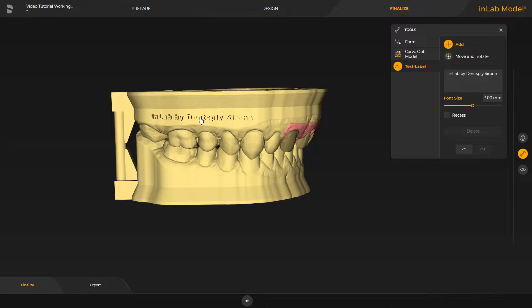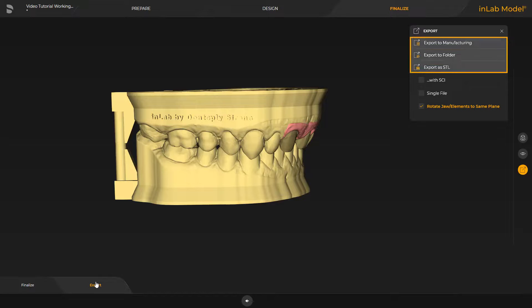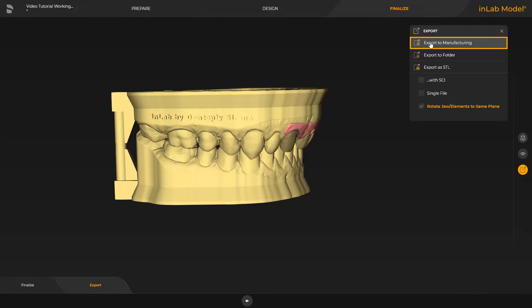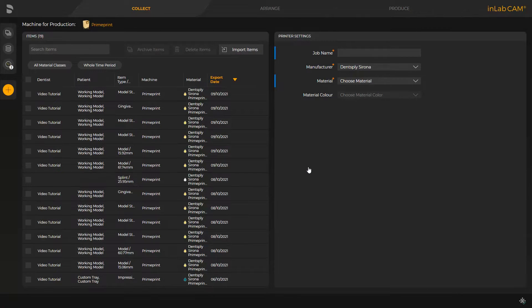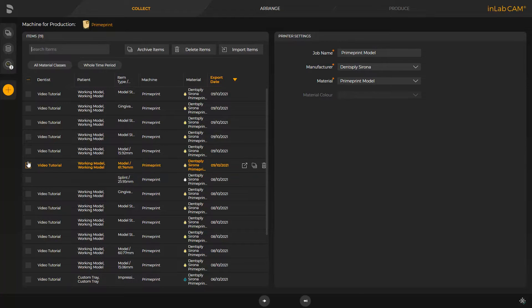In conclusion, we switch to the last step, the Export step. Here, different export options are provided. Since the CAM data folder has already been determined, as mentioned earlier, the case is seamlessly transmitted to the InLab CAM software with just one click on Export to Manufacturing. We confirm by clicking OK, and after the InLab CAM software is opened, all cases previously transmitted are displayed. For demonstration purposes, we select one of the models and can either select the so-called Fast Track by tapping the double arrow, or we can switch to the next phase, the Arrange phase.